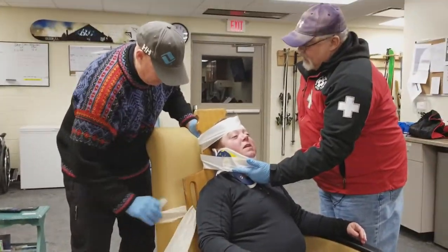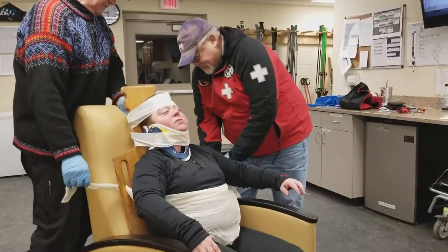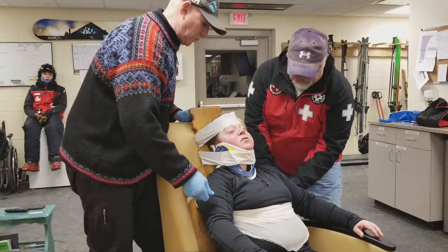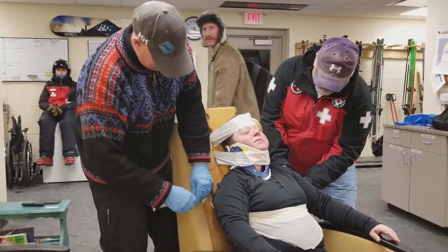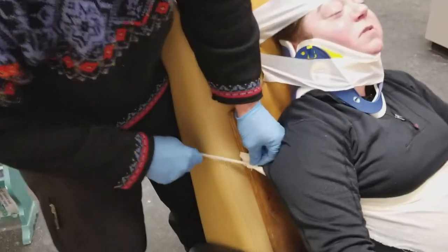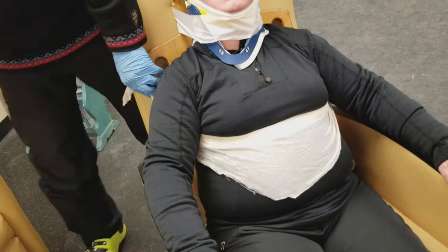Sally, how do you feel? I feel immobilized. Okay. Now we're going to strap her to the floor here. Is that pretty tight, Sally? No — the straps are killing me. And those eyebrows are taped. I'd say you guys are dropping like flies.